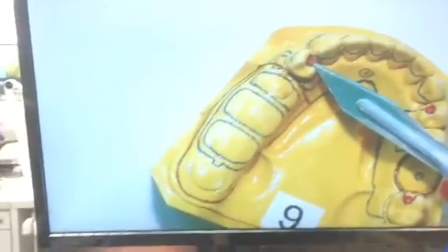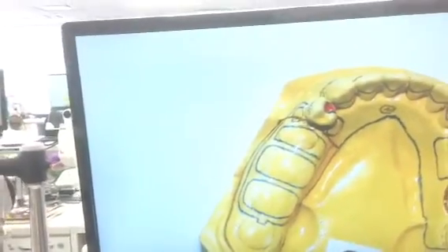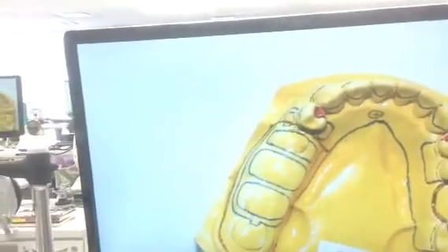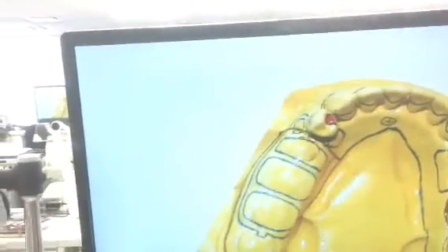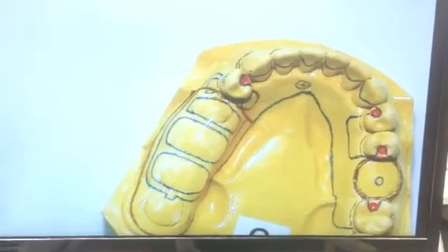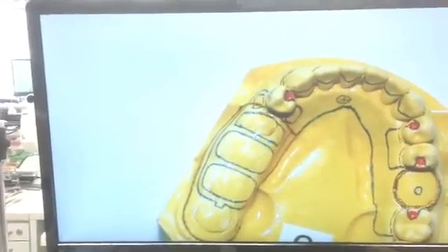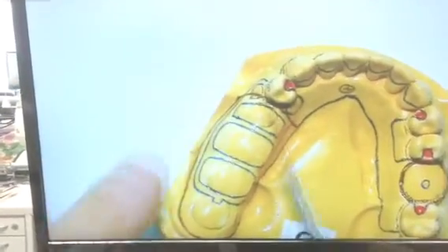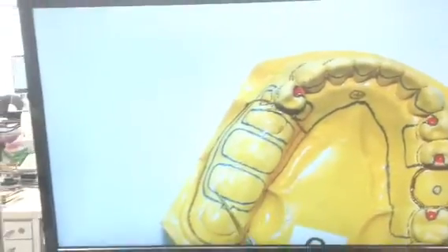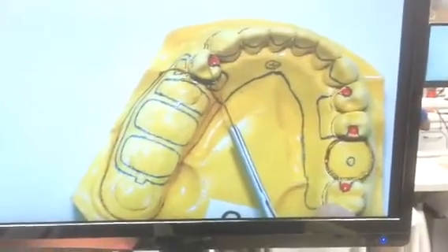Yes, we can argue about, well, couldn't I use a distal rest and use a combination clasp where I'm using a Roach? Yes, you can. But why? Okay? Don't make your life complex. If you have a distal extension area, think RPI, RPA. It's your only two choices.